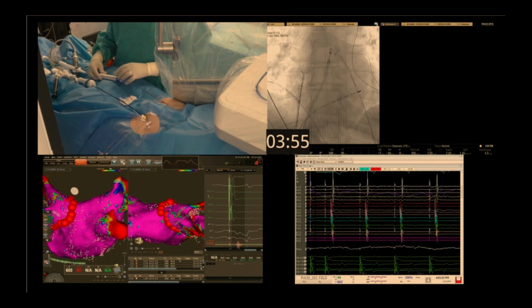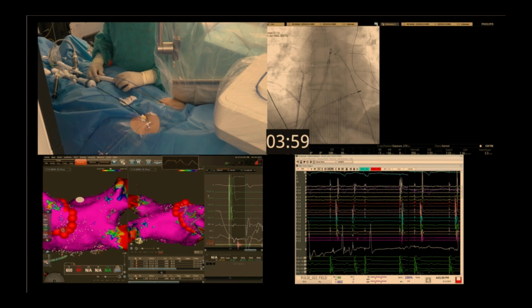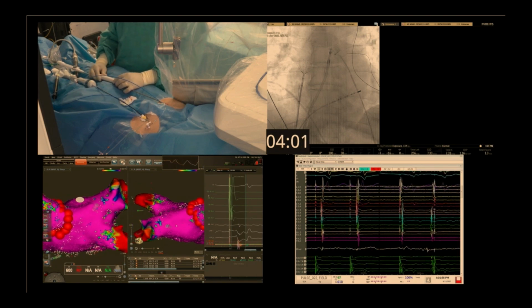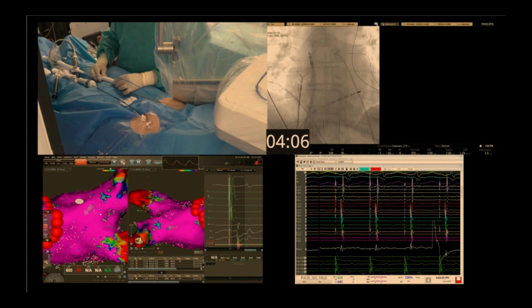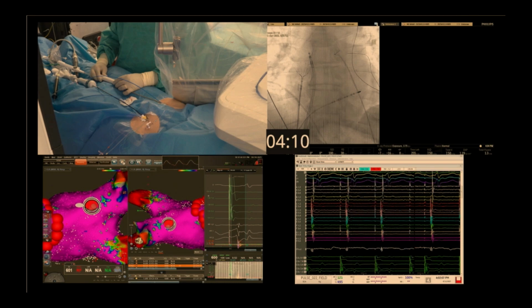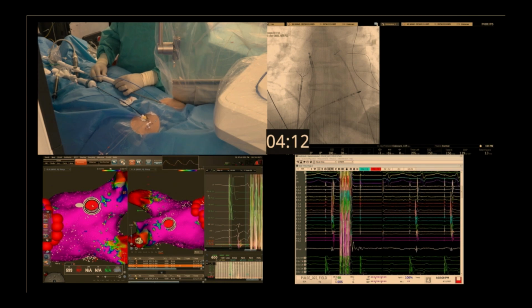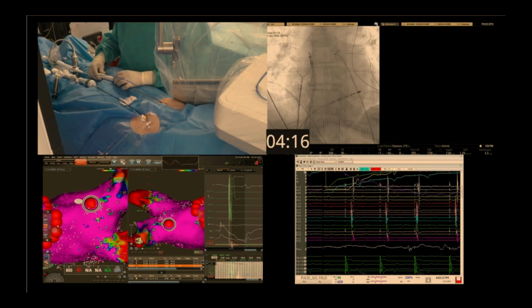Microbubbles can happen for multiple reasons. The two main ones. Is there any thermal effect? We don't believe so, based on the preclinical data or benchtop data. We're doing brain MRIs, obviously, in this series of patients, just to prove to ourselves that we have no silent cerebral ischemic events. That's an ongoing project, obviously.